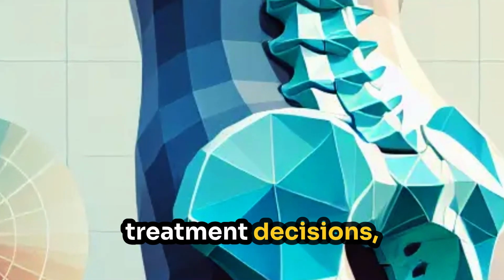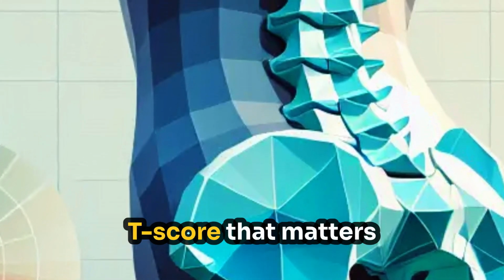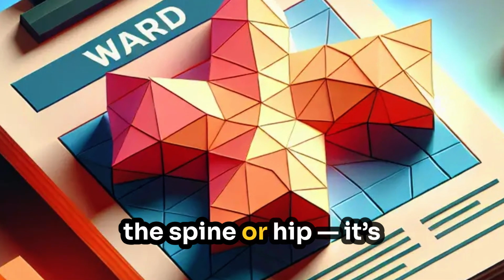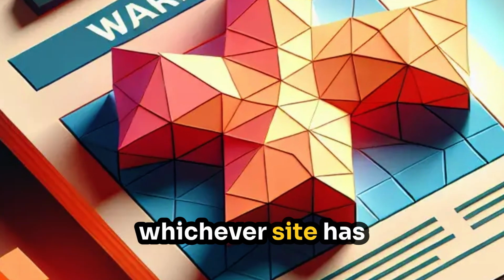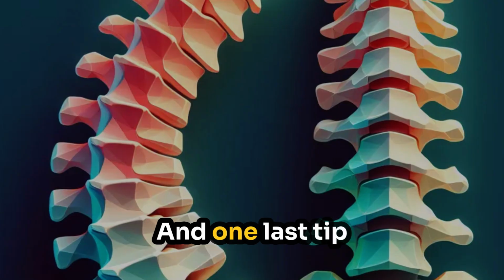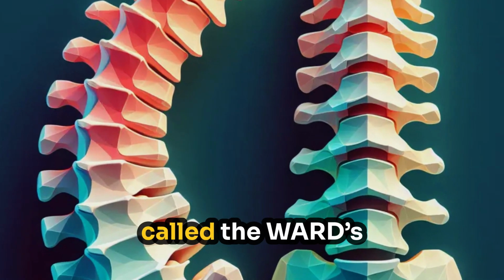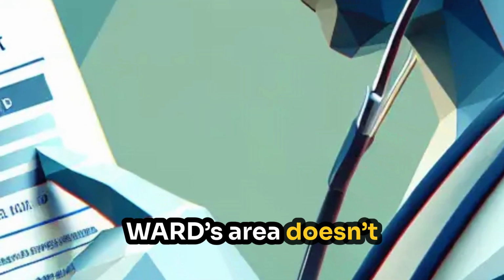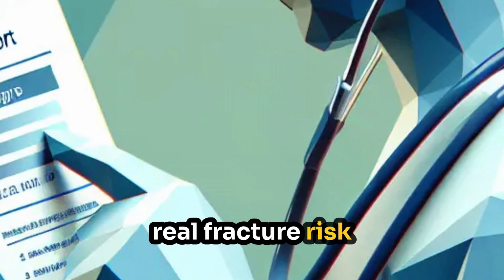When making treatment decisions, it's the single lowest T-score that matters. It's not about the cumulative average of the spine or hip. It's whichever site has the worst number. And one last tip, you'll see something called the Ward's area on your report. Ignore it. Ward's area doesn't correlate well with real fracture risk.